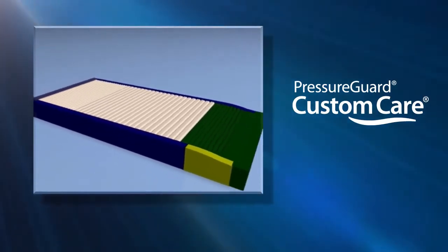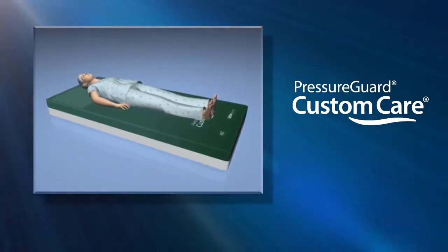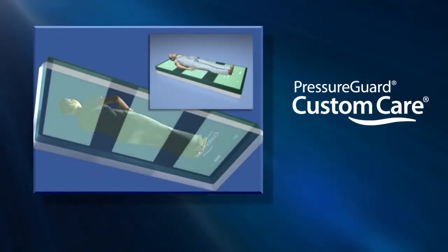Above the surface of the mattress itself is the unique design of the antimicrobial bi-directional stretch cover. Beneath the scapula, sacrum, and heels lie the shear minimizing bands of the innovative shear transfer zones.